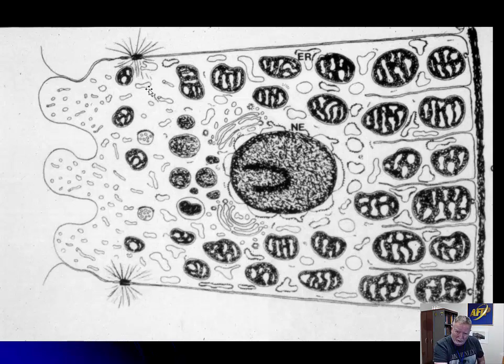We will probably have more lucency of the cytosol as all that stuff that was compressed starts. The cell is starting to swell. Probably it should have been drawn as being sort of bloated on the sides, and you can often see cells at this point, even though they're epithelial cells and they're bolted together, they're swelling and they're sort of compressing the ones next to them if they're not similarly affected.